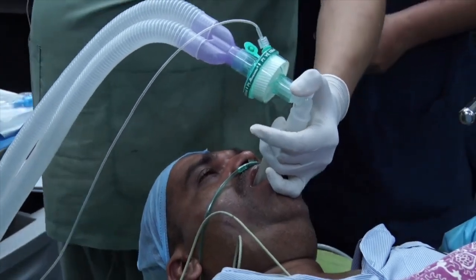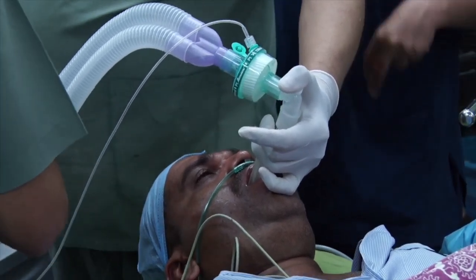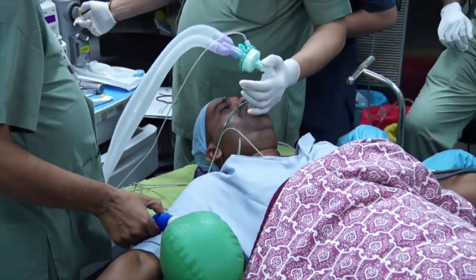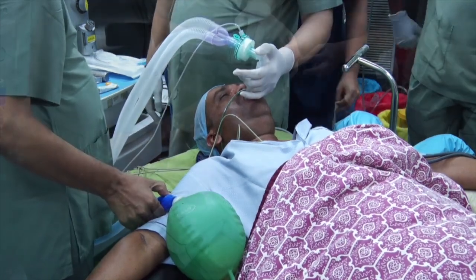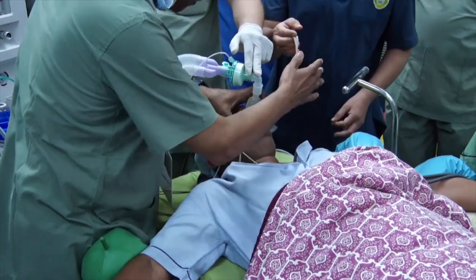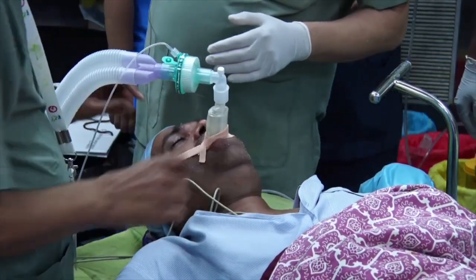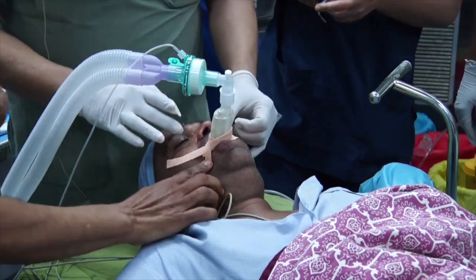The patient should start breathing — already started breathing spontaneously. Build up your concentration, leave it on the higher side. One thing to remember with propofol: you will get some involuntary movement. That does not mean the patient is not asleep — it's a known fact. Just let the volatile concentration build up and you're done. Tape the eyes please.